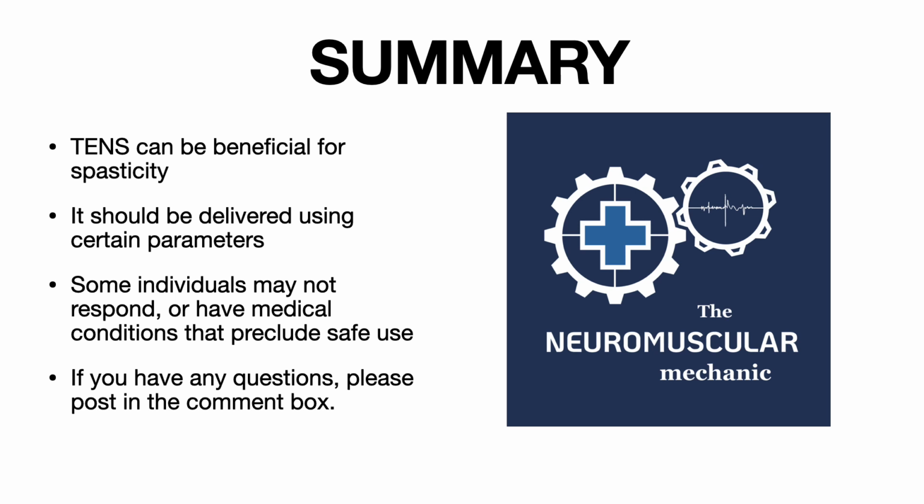Now, certainly there are some individuals who may not respond, and again, you should talk to your healthcare provider to make sure it's safe for you to use, but also to get some instruction and guidance about what muscles are spastic and problematic, and therefore where you should put the electrode pads.